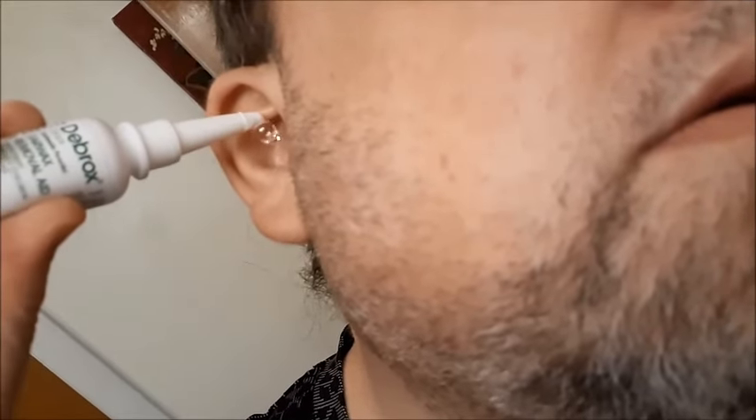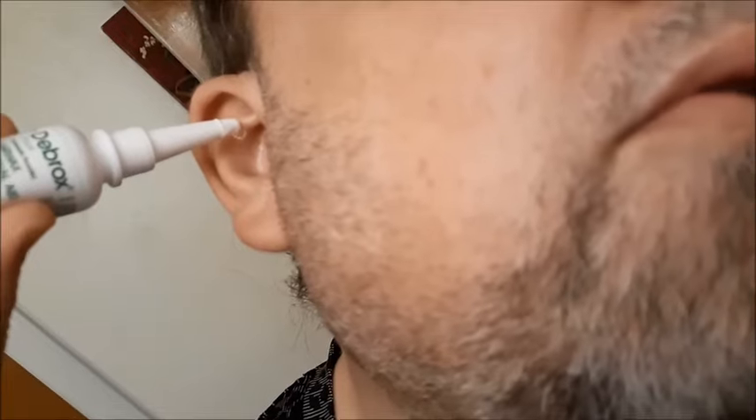So now we're going to go ahead and drop five to ten drops of the Debrox into my ear right now — one, two, three, four, five, six, seven. That should be good.